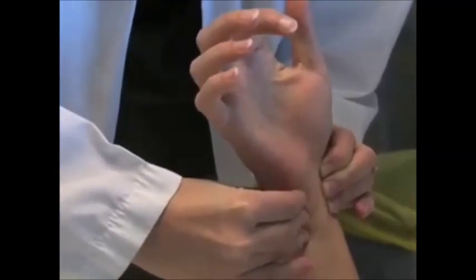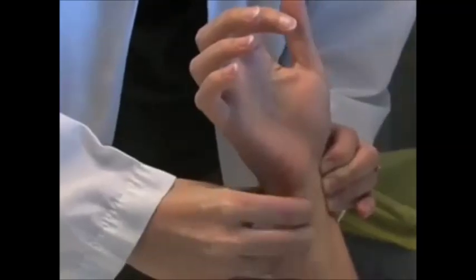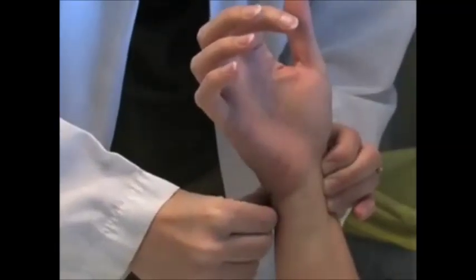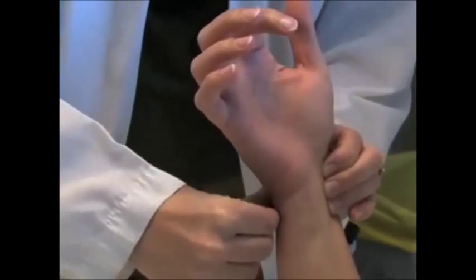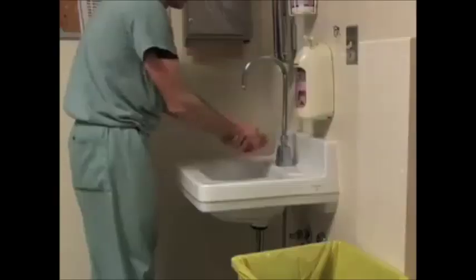The patient's palm should appear blanched or pale. Now release pressure only from the ulnar artery. Adequate collateral circulation is indicated by the return of normal color within 10 seconds.